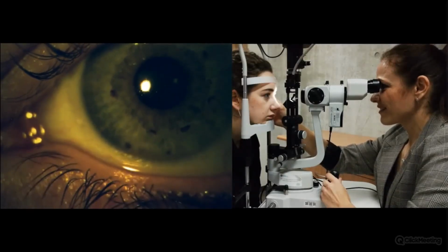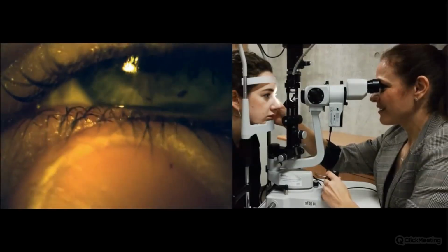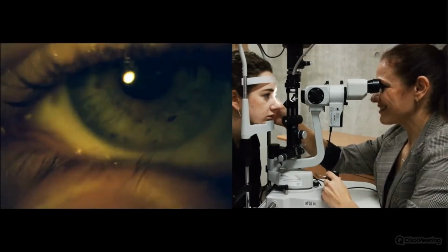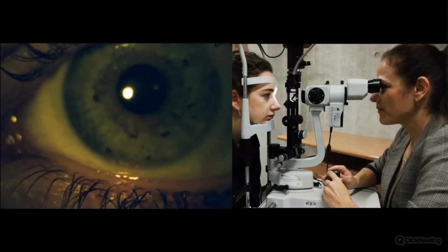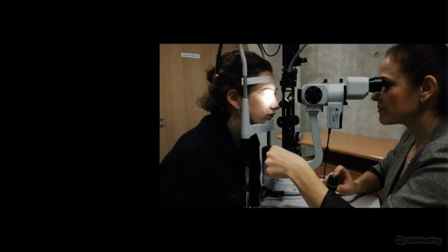If I need to choose, I would rather choose the lens that was in the right eye, because for these lenses I need to press stronger, and the lens comes back slower into place.